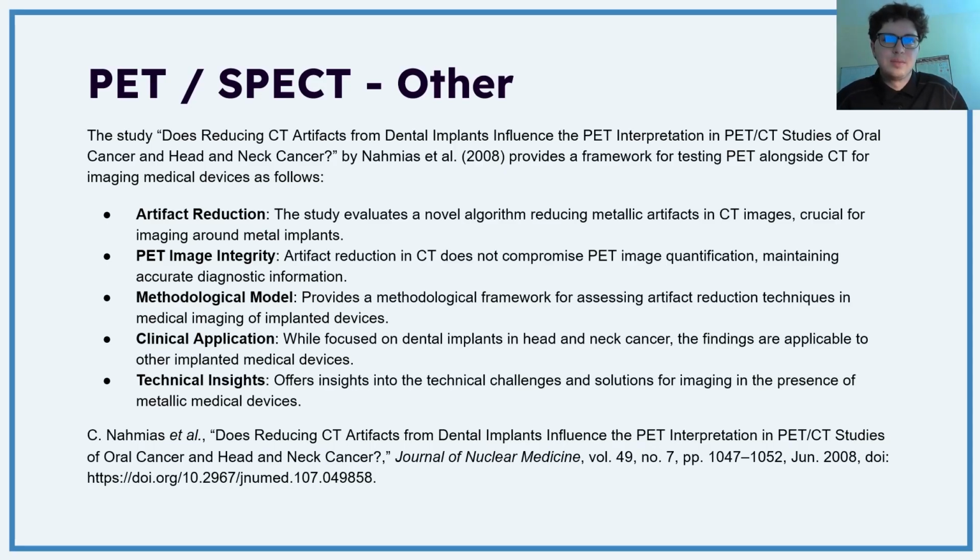So in this case, it was dental implants, but it provides a methodological model for assessing artifact reduction techniques in medical imaging of implanted devices in general. Thus, this is going to be acceptable for any other medical device and much recommended. On the clinical side, it's, like I said, focused on dental implants, but it's applicable to other medical devices. On the technical side, it just offers some insights into the technical challenges and solutions for imaging with metallic medical devices specifically. Seems like metals are going to be the main problem with all of these imaging modalities.